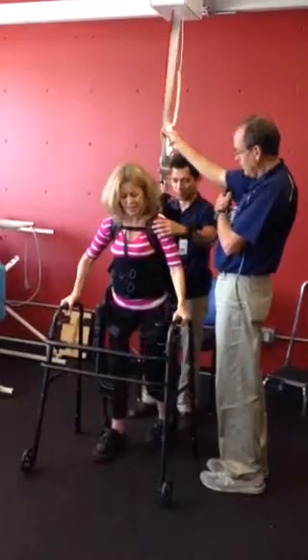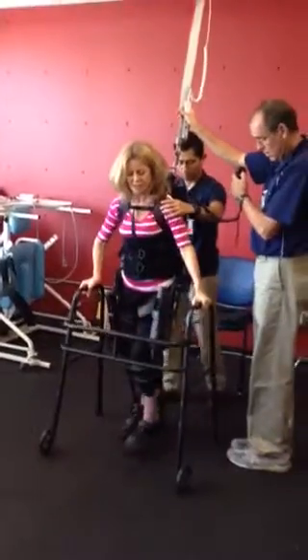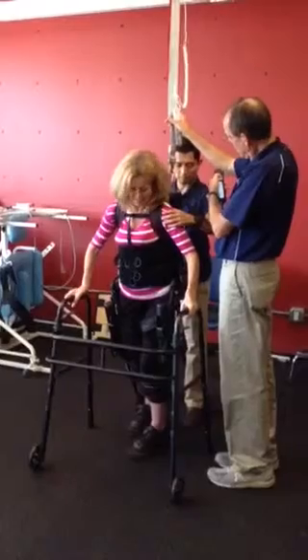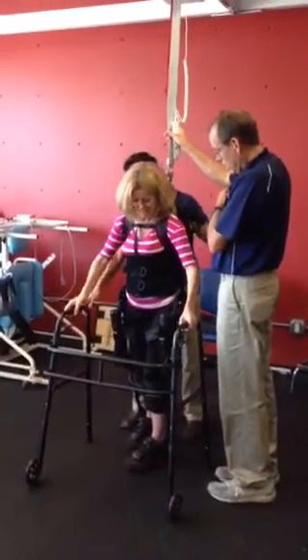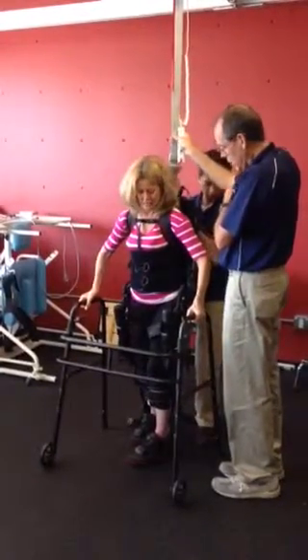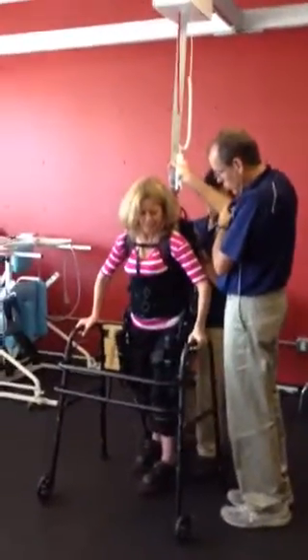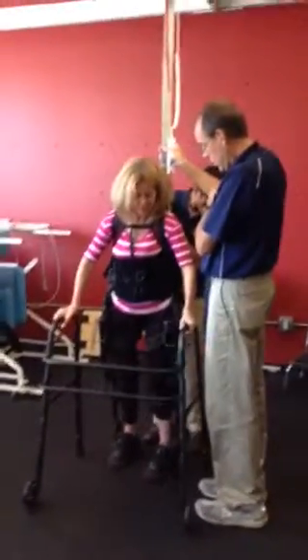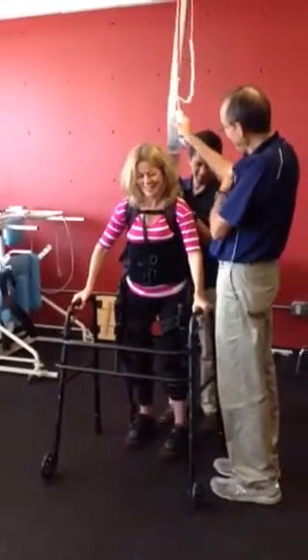How was that? Move to the right — now you're going to move to the right and forward a little bit. There. And now step. Good. Now take your weight to the left. You're doing it, Len. So we're going to do that dip — just going to push down on your arm. Push down on your hand. I'm going to line up your feet. Wait — one, two, three. There you go.